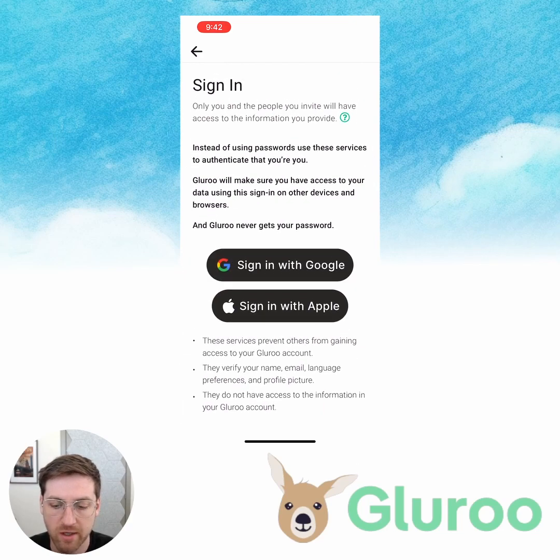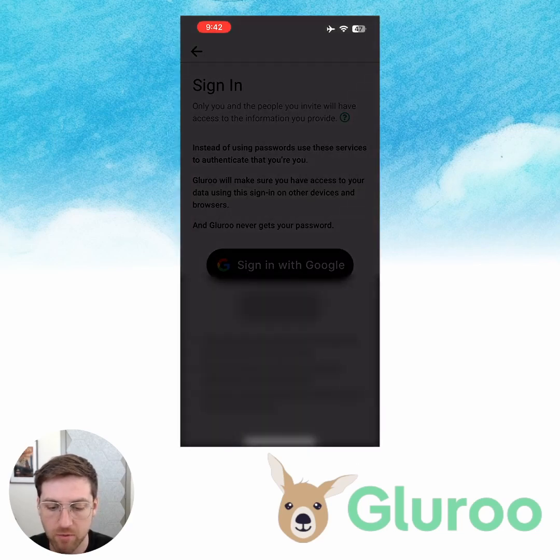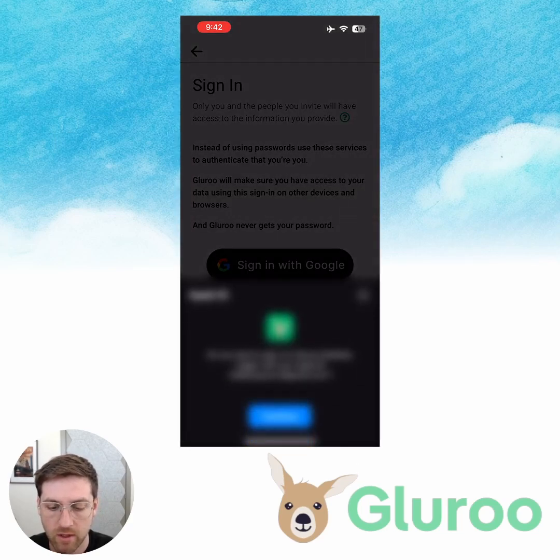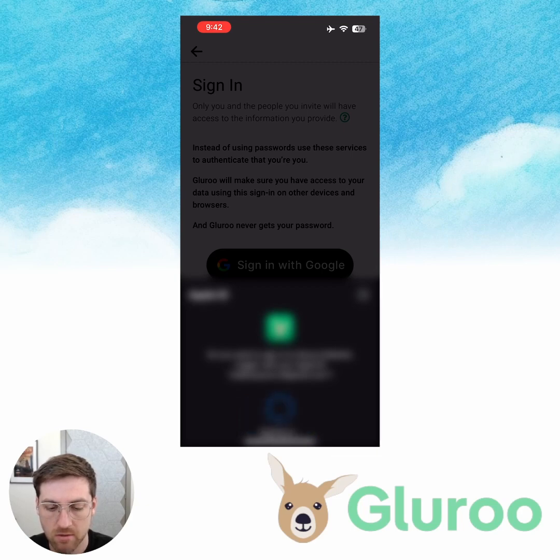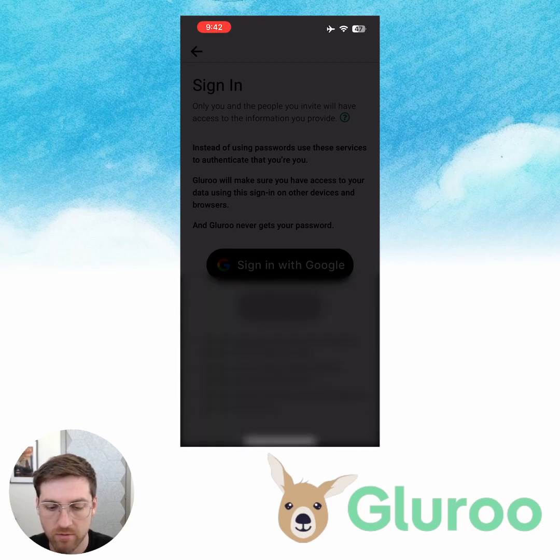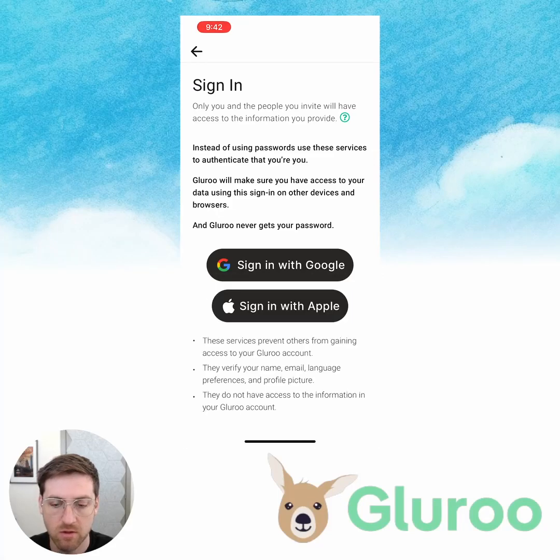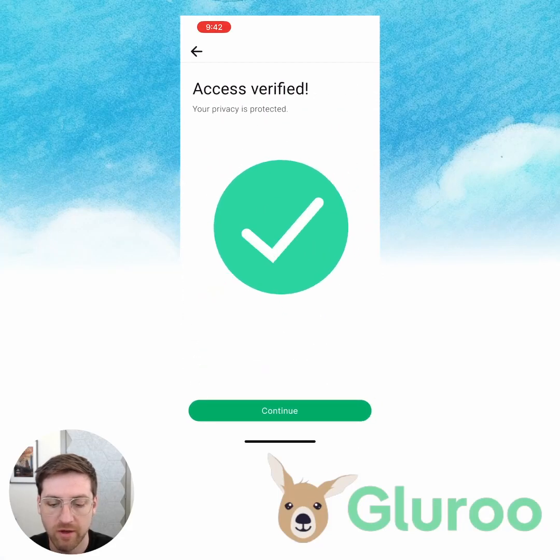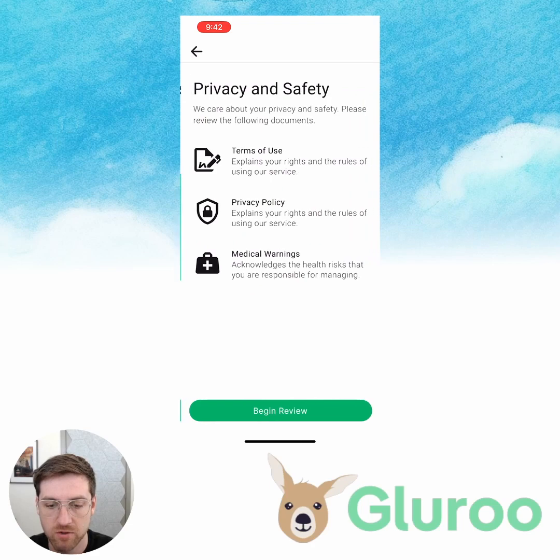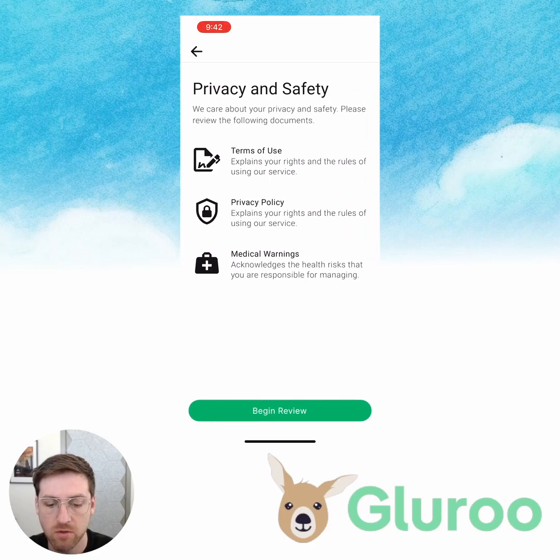Now signing in — I'm going to hit Sign in with Apple and that's going to pull up my Apple ID. Verifying my face. And we have been verified, so we're going to continue.